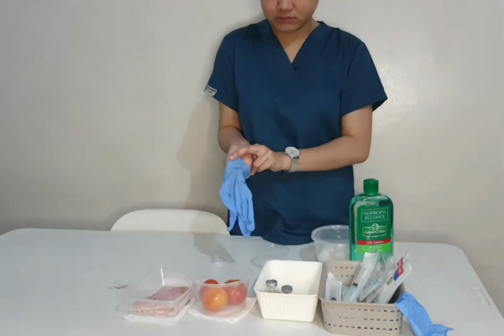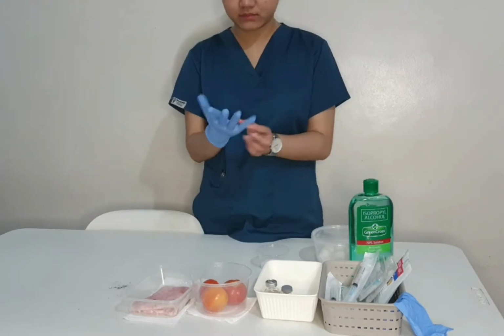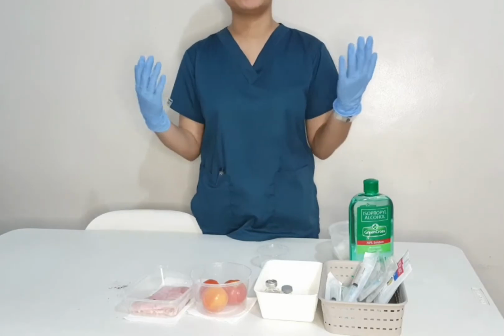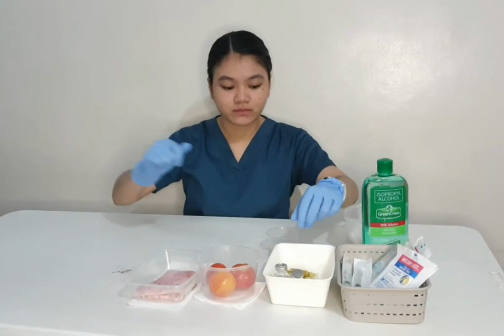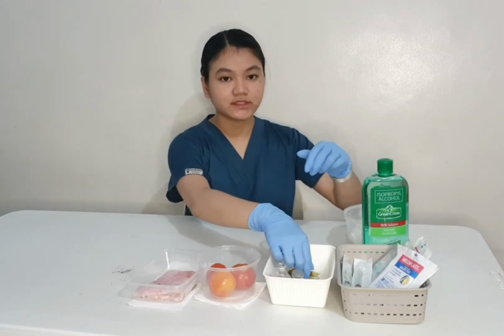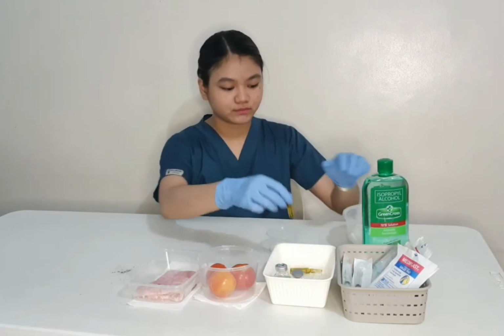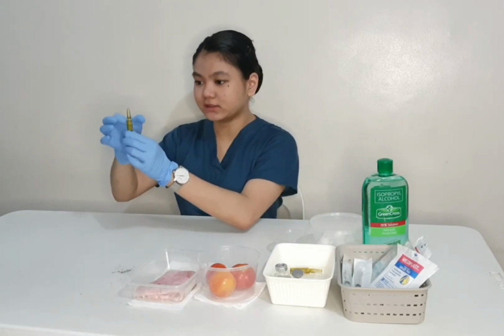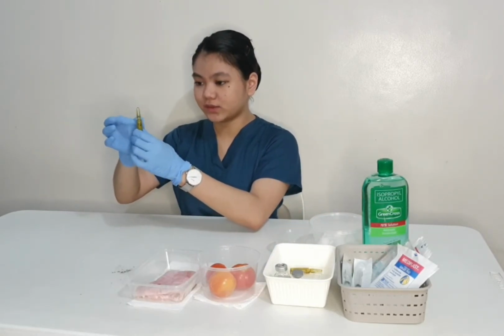We can now proceed to our procedure. Let us now prepare the ampule. Let's just flick it a little so that the liquid will go down.